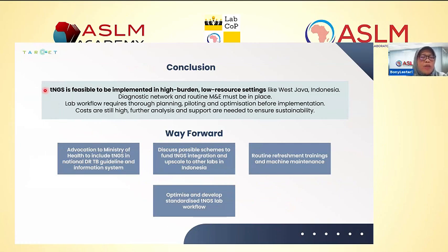So to conclude: first, this technology is feasible to implement in a high burden and low resource setting like West Java, Indonesia. But the diagnostic network and routine monitoring and evaluation should be in place. The lab workflow requires thorough planning, piloting, and optimization before implementation, and even though we provide the service, the optimization is still running. Costs are still high for now, so further analysis and support are needed to ensure sustainability.